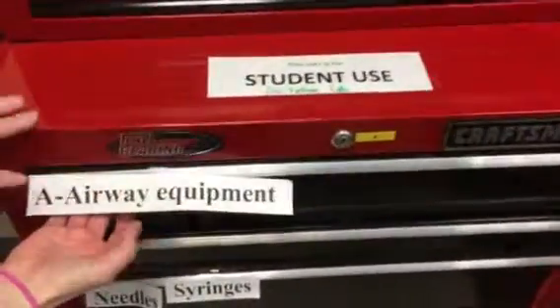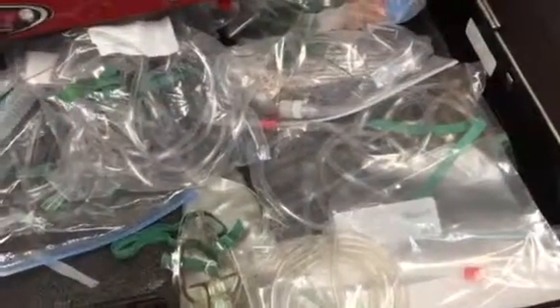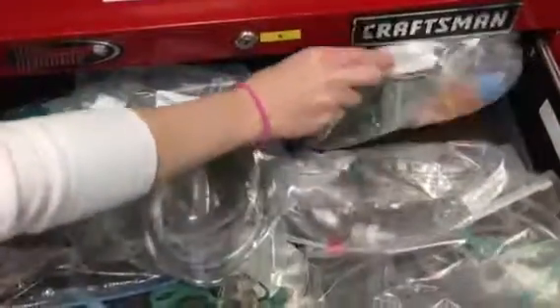The drawer following just says airway equipment. Anything you should need for a respiratory problem is going to be found in here. Whether you need a mask, a nasal cannula, nebulizers, everything you will find in here. The last one, all the way back, is the Venturi mask.